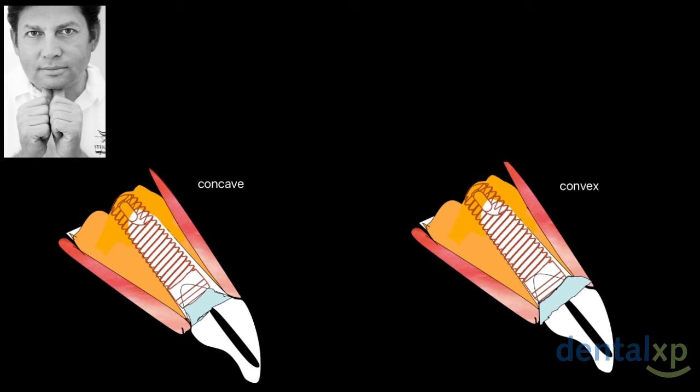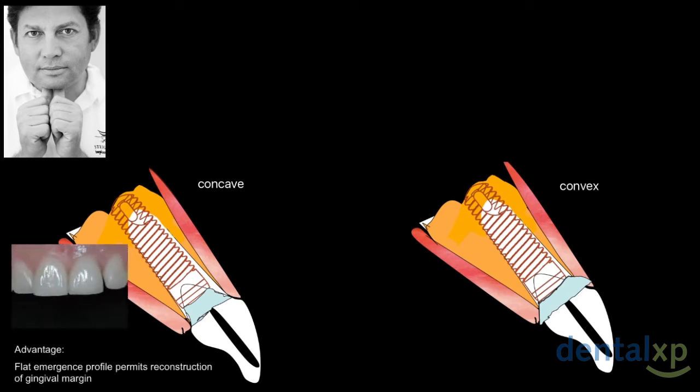the facial aspect of the abutment. Is that true? That's true if you take frontal pictures. And what is happening is that this permits a very good aspect from the front. We have implants which have a very strong platform switching, conical connection. That's when we have a very good aspect from the buccal.